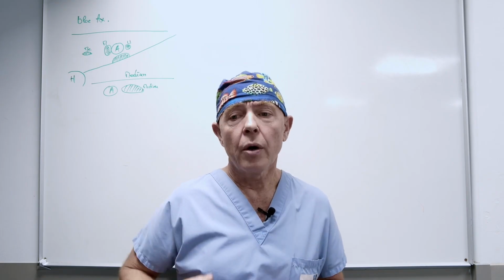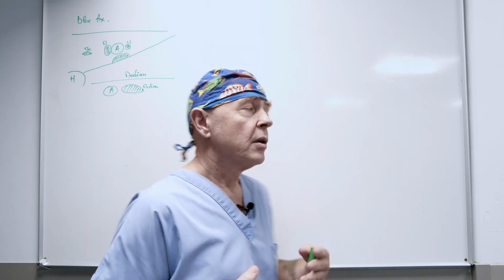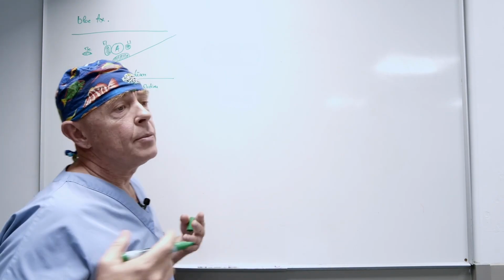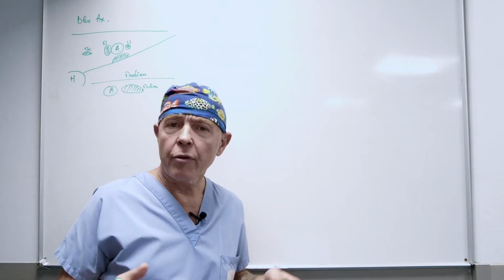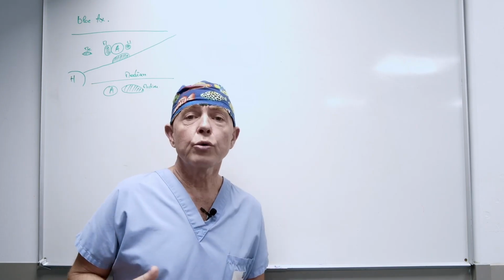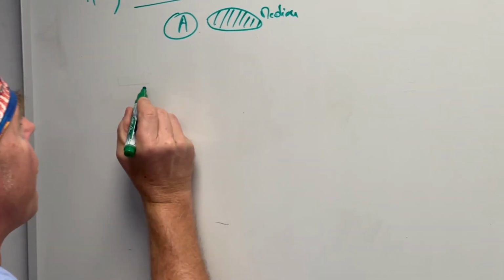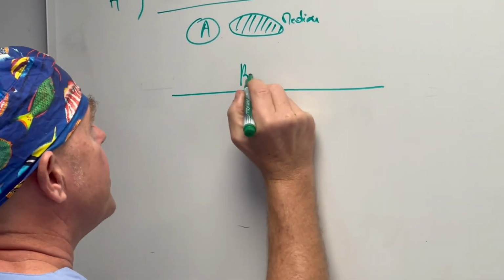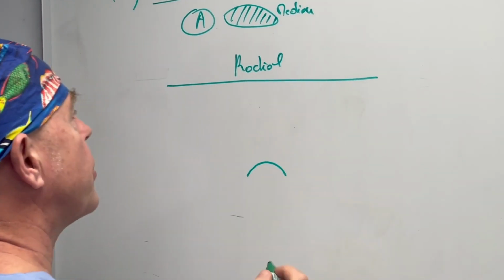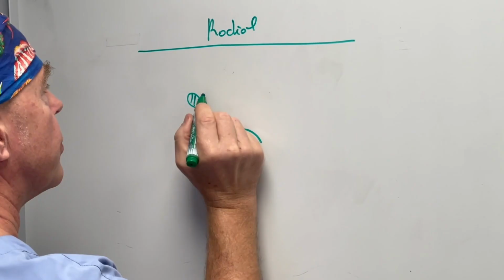Of course, as you gain experience, you can gradually learn the names of the muscles and all that, knowing that your main landmark is the artery and that the median nerve is almost always there, even in small children, babies, spastic individuals, and so on. It's really an anatomical ultrasound feature that we find every time. A very helpful addition is the radial, as I mentioned earlier. We rebuild the skin, the radial nerve. Here you have the humerus bone, and subsequently it appears like this. Forms somewhat like elongated droplets. That is the radial nerve.